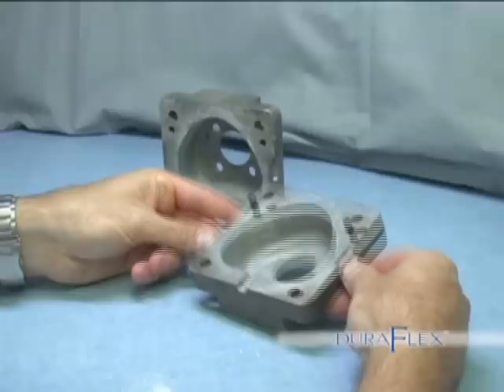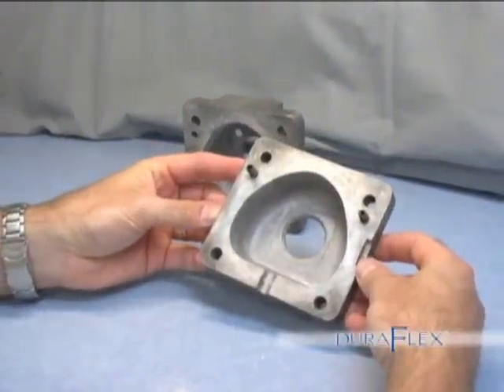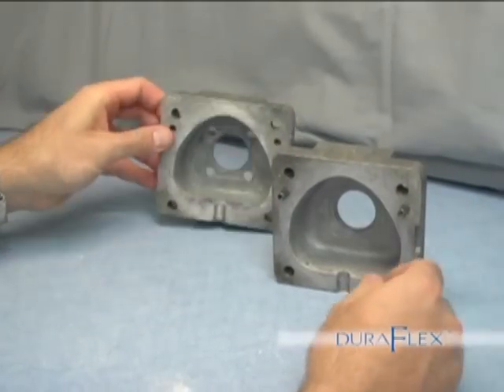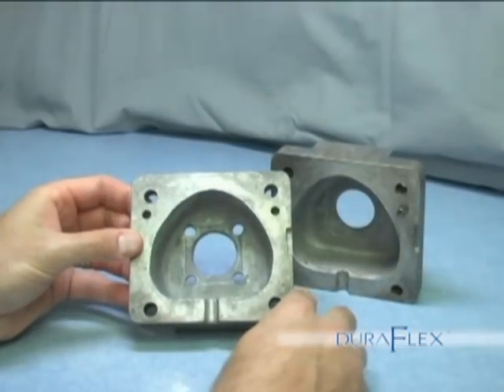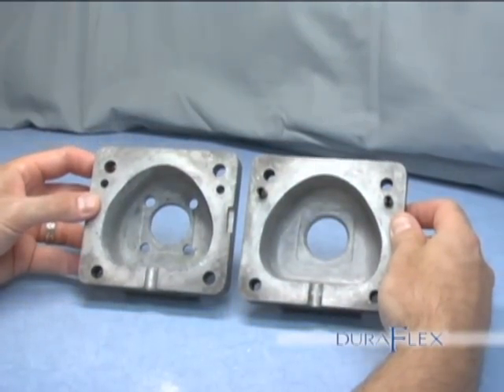Investing the case. Here we have the flask for the Big Shot machine. The only difference between the two halves is the smaller holes in the top half. The holes allow air bubbles to escape. In the first step of the process, lubricate the two halves of the flask.